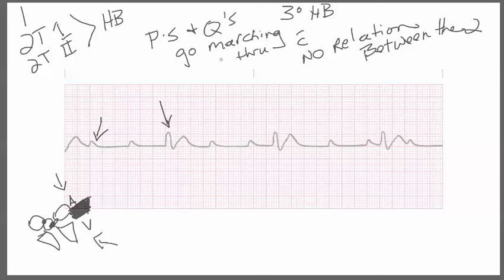So when you see them on an EKG they have no relationship. How do we know this is taking place? Well first of all, you can do your R-R interval because that's what we know first. When you look at your rate, you've got a rate of 30. You have a QRS interval right here and if you bounce the ball the QRS is constant.